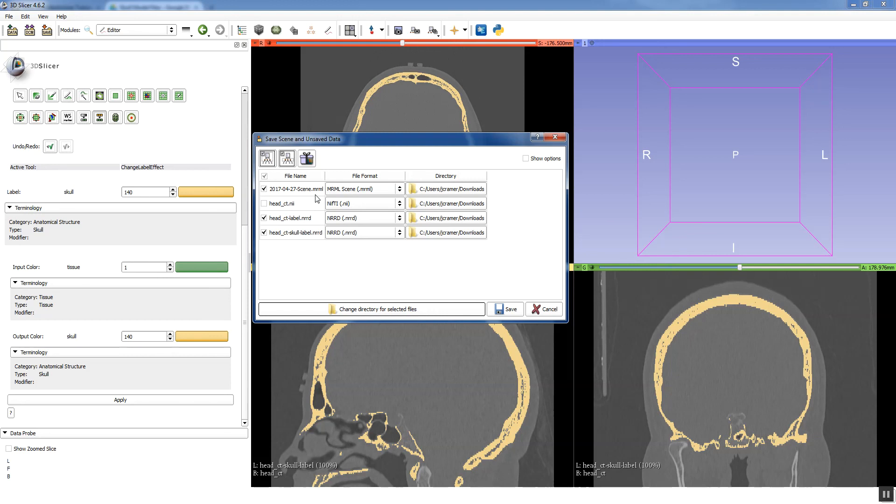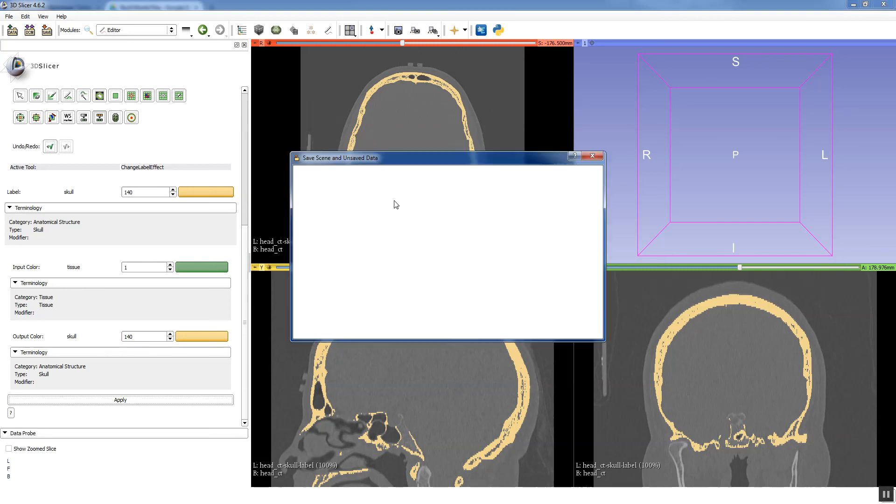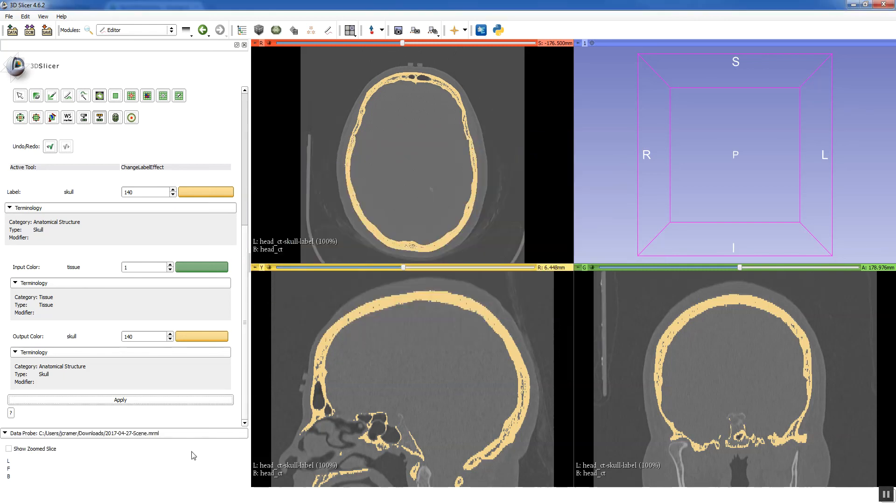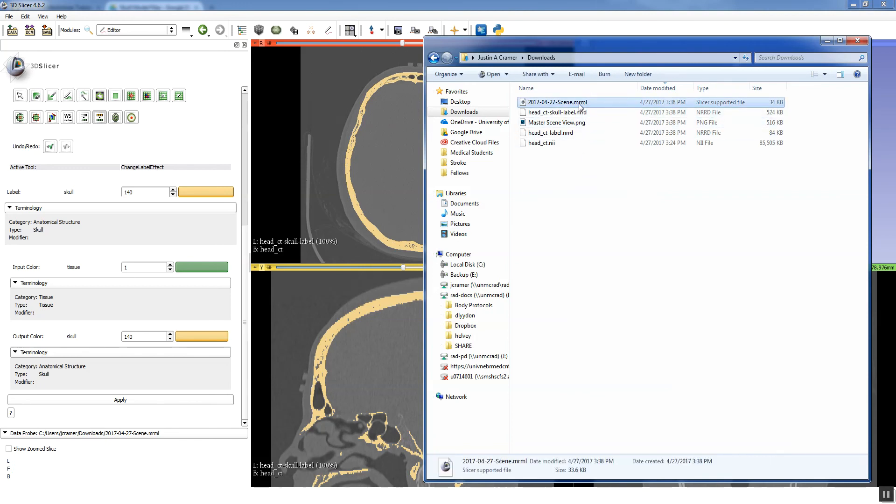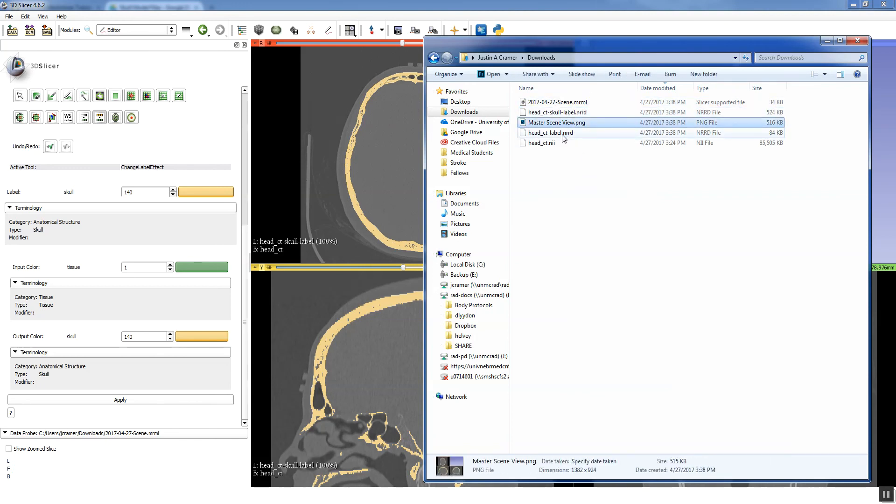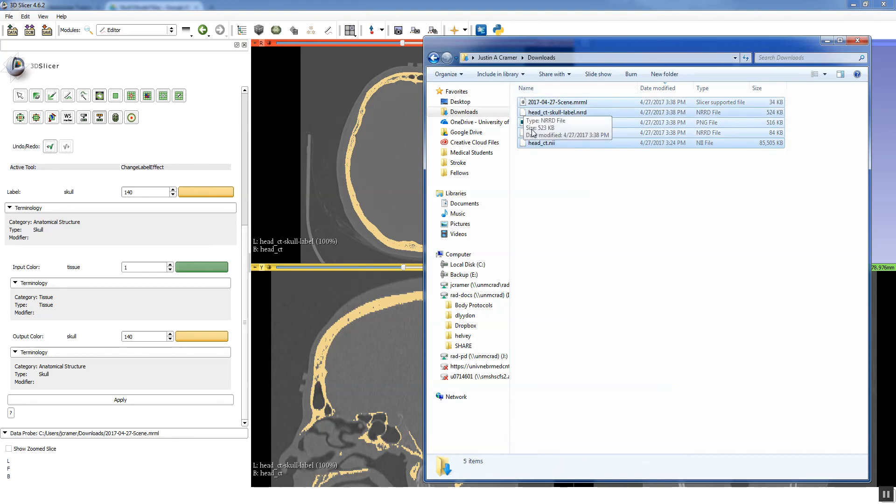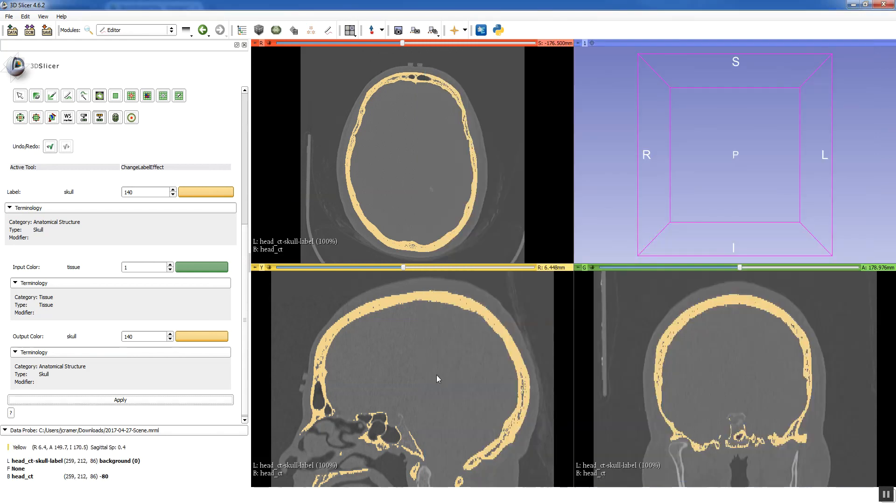In Mac, if you open up slicer and then go to file, open, and open up the MRML file, it'll still work though. So let's save all of these. And now if you go to the downloads folder. You can see there's an MRML file. And some other files. These all need to be in the same directory. But you can actually copy and paste all these files into different directories as well. You just have to keep them together. So that's everything.